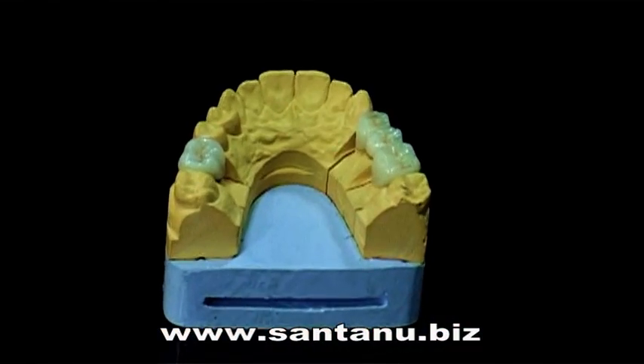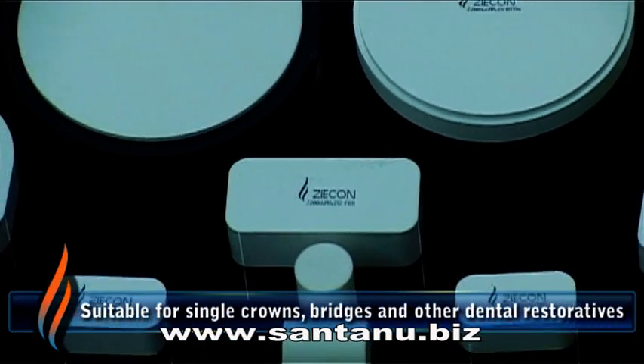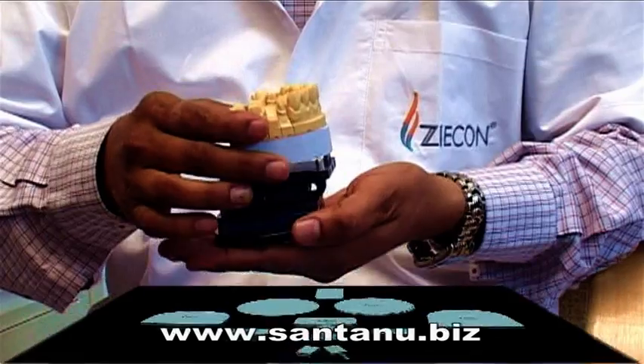The blanks are suitable for single crowns, bridges and other dental restoratives. These are available in a wide range of sizes and thicknesses.